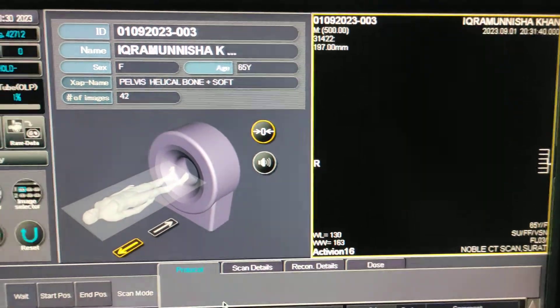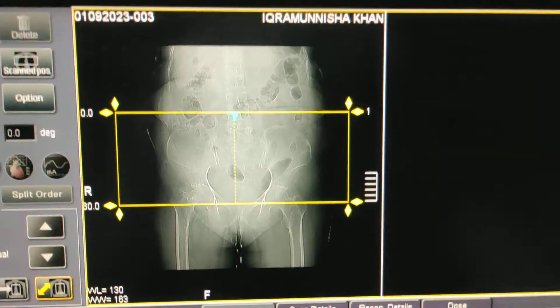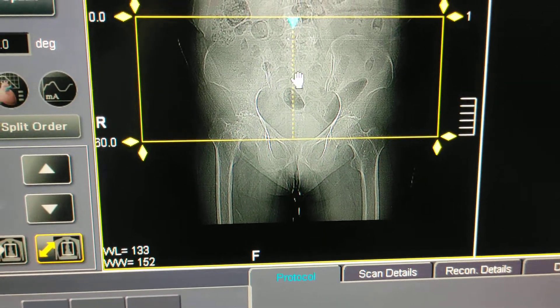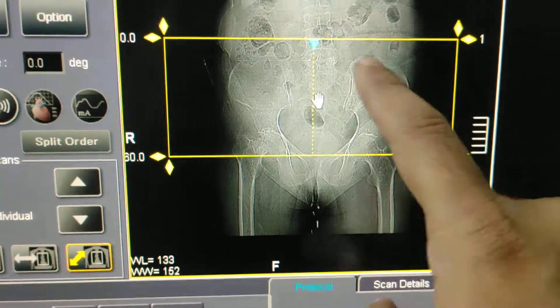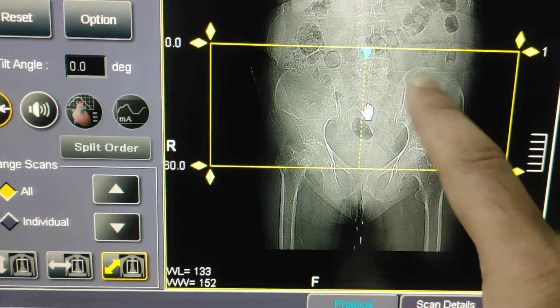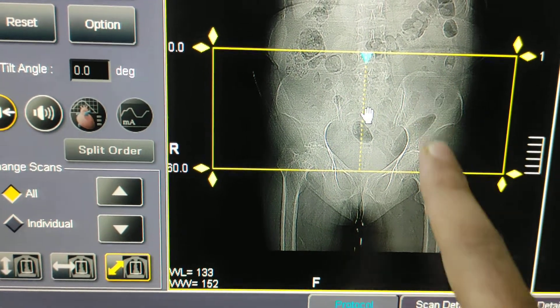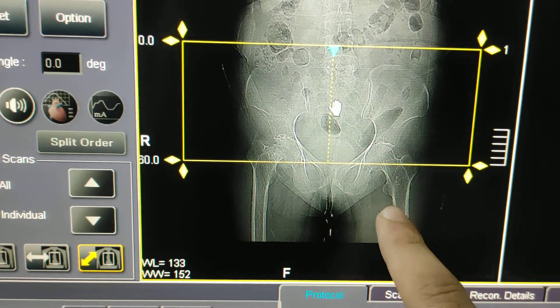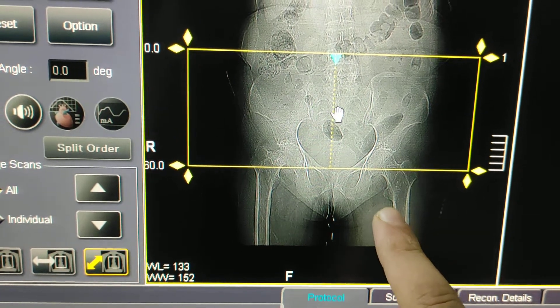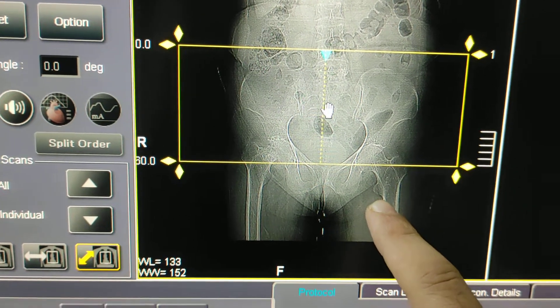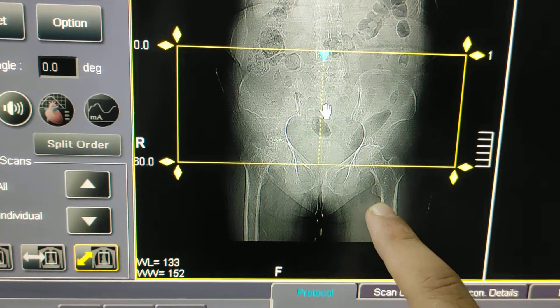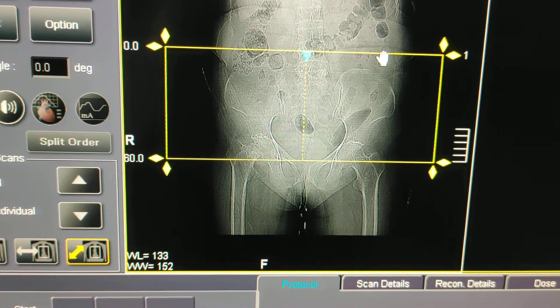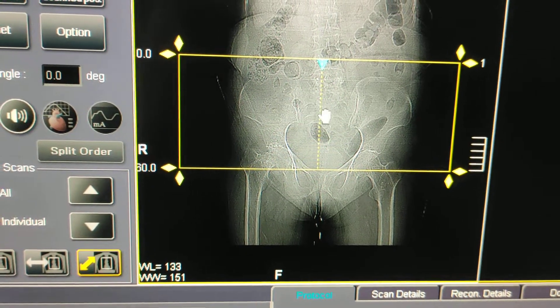Now here is the new scanogram. I will show you the exact planning. Here is the iliac bone and iliac crest. You have to cover the head and neck of the femur — this is the greater trochanter, this is the lesser trochanter. You have to cover up to the lesser trochanter.